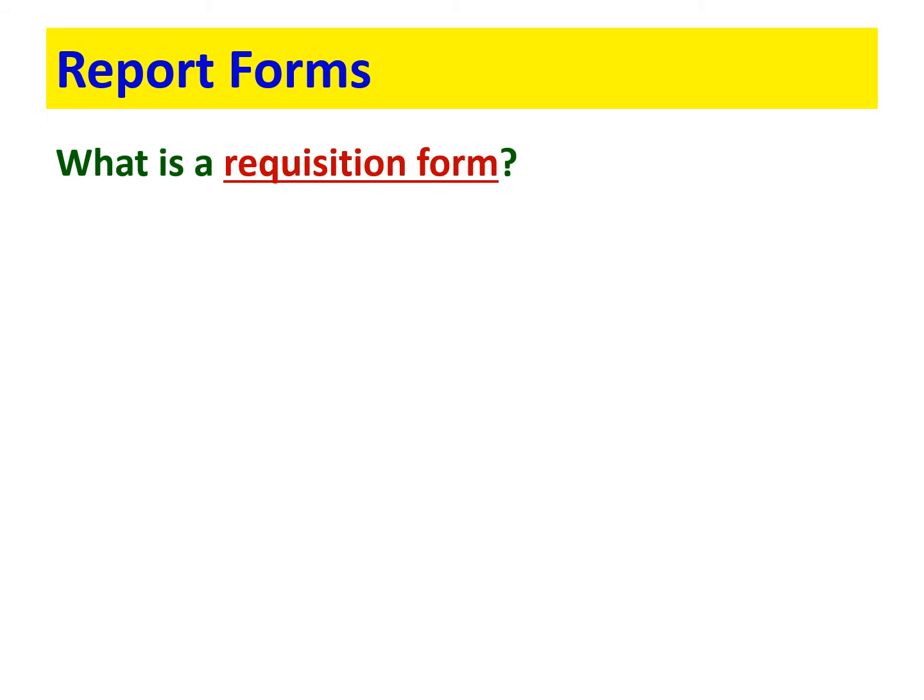Remember, you need to understand what our report forms are. Remember, documentation is vitally important. These can be called into the court for court documents. As you know, there are different organizations that come into our labs and inspect us, so we must make sure that all our report forms are done accurately and correctly.